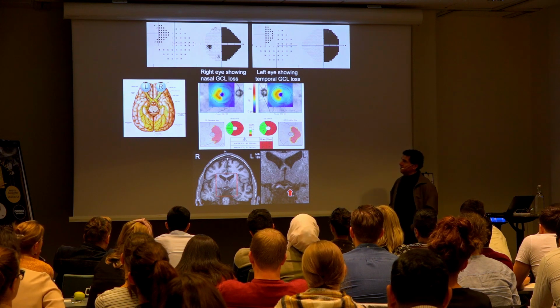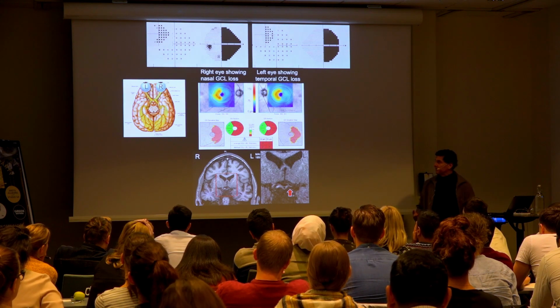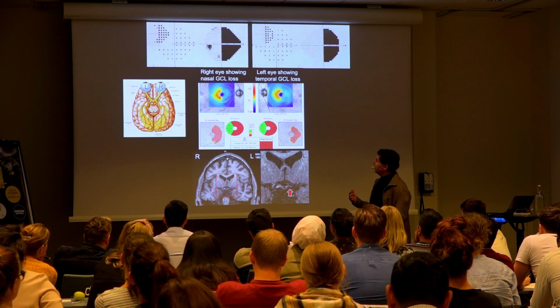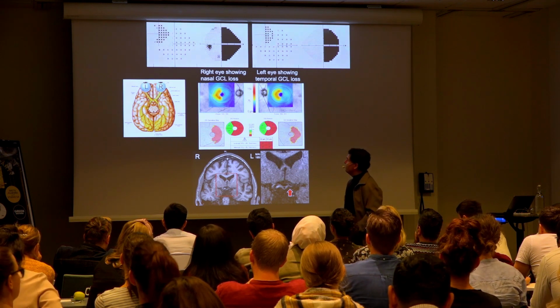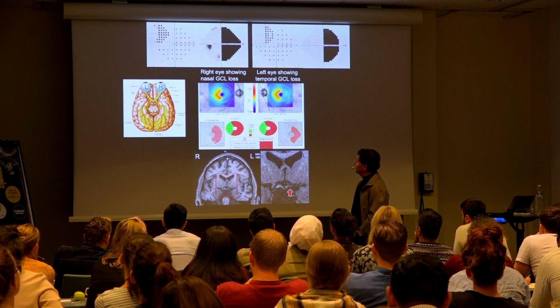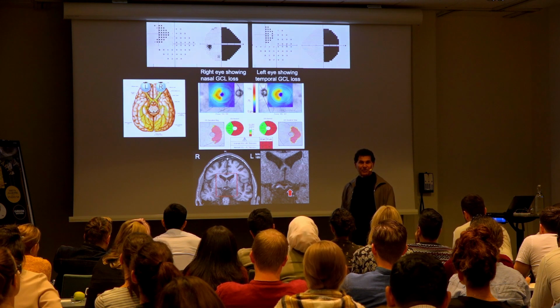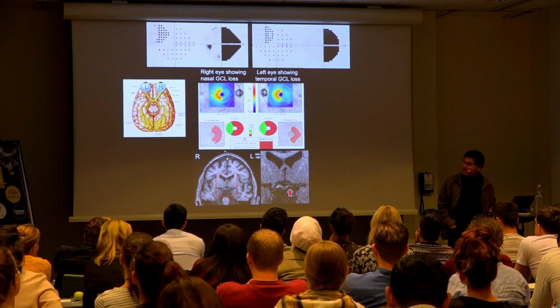So that's a good example of an optic tract, and as we talked about in the pupil lecture, they should have an RAPD. And which eye of these two should she have the RAPD in? The right eye. Right, because that's the one with the nasal retina or temporal field loss. So the eye with the temporal field loss has the RAPD. Good.